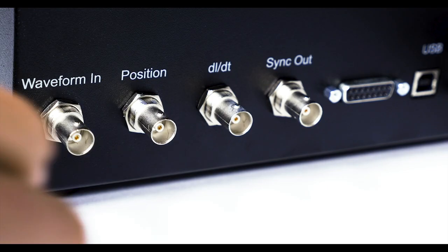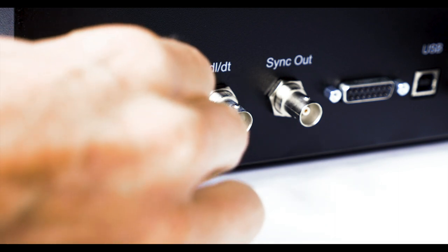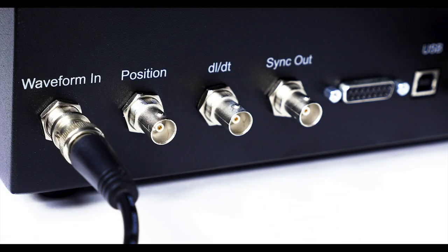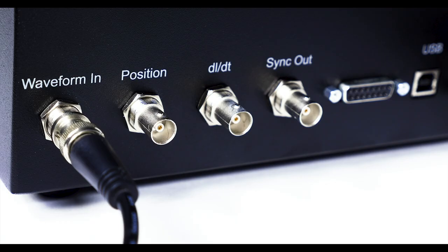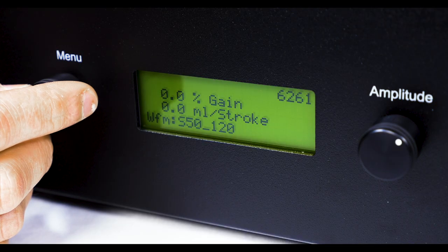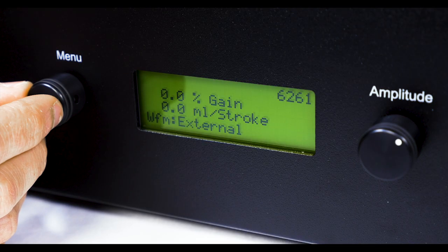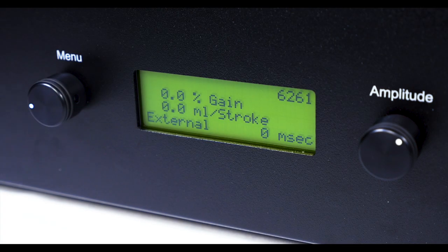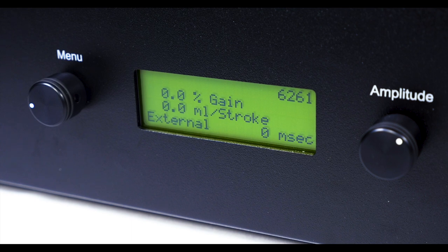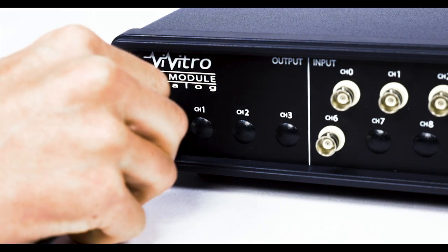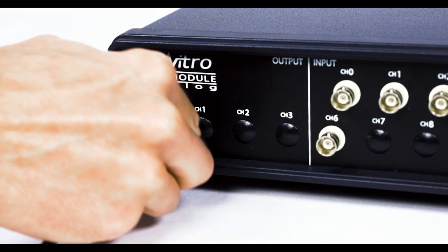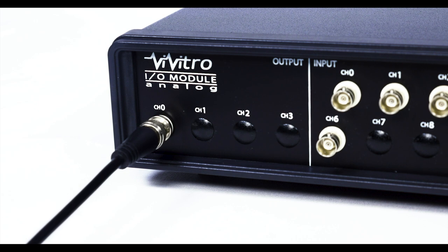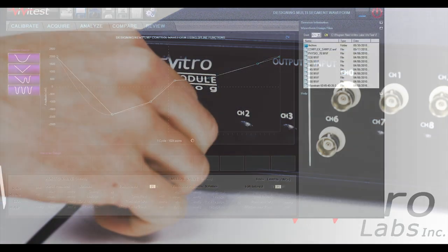The waveform BNC connector can be used to drive the super pump when it is in external waveform mode. Waveforms can drive the super pump from an external source outputting a positive or negative 5 volt signal. Examples include a waveform generator or the Vivitro I.O. module and Vivitest software.